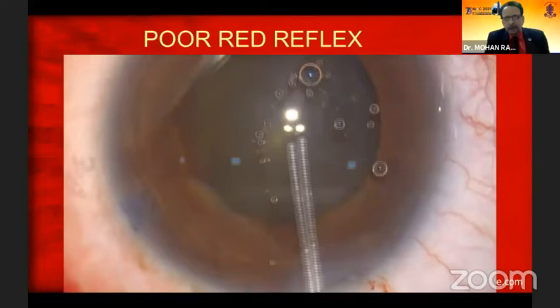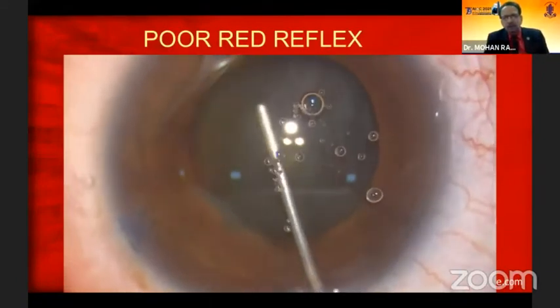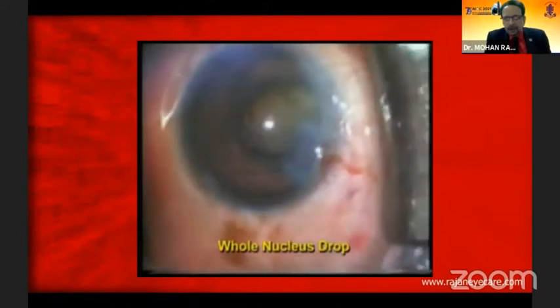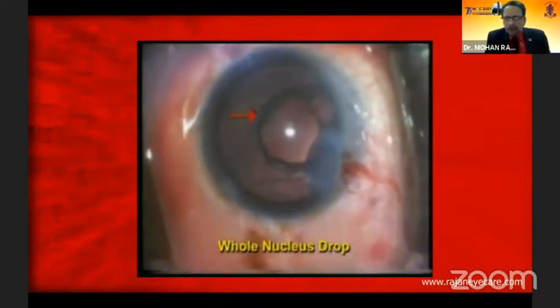This is a relatively softer cataract. I just popped it up once I did a capsular rhexis and did the phacoemulsification, slow and gentle. Pre-existing PCR: please understand these are all vitrectomized eyes. Sometimes a number of multiple injections of Avastin or Lucentis are given. Be careful of these patients.